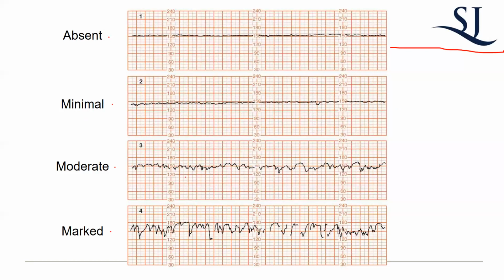This is your moderate variability, as you said, and marked variability is kind of, it's not bad. It's not moderate, pretty much. Actually, when I was in residency, I was able to ask one of the older guys who kind of was involved with the creation of it. And they were just like, well, it's not moderate, which we know is consistently associated with good things. So it's not that marked is bad. It's just not moderate, right?